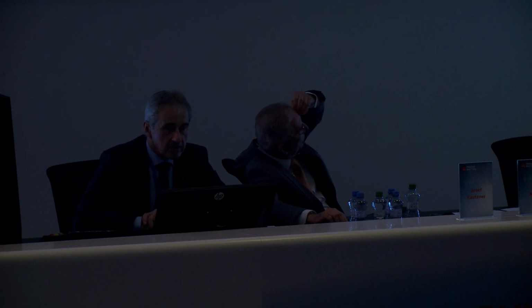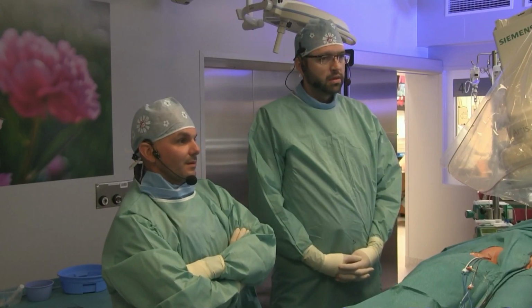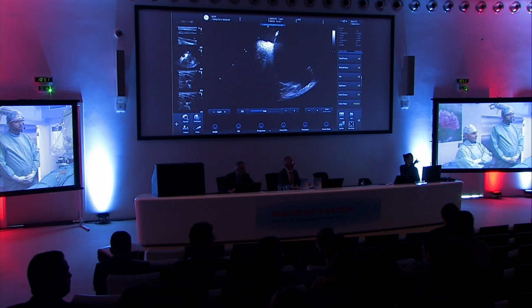So that was a comment. Actually, the pacing catheter was real low in this case, just above the jugular valve. Good. Any more questions, please?